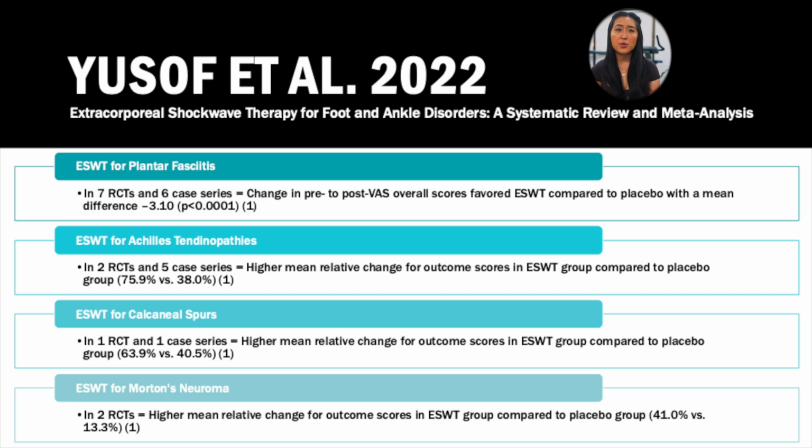As you can see here, more evidence should be done before we can establish the scientific backing that shockwave is effective for these two latter lower extremity pathologies. But of the limited evidence that is available, all of these lower extremity pathologies seem to have some evidence to support the clinical efficacy to help patients improve their symptoms.